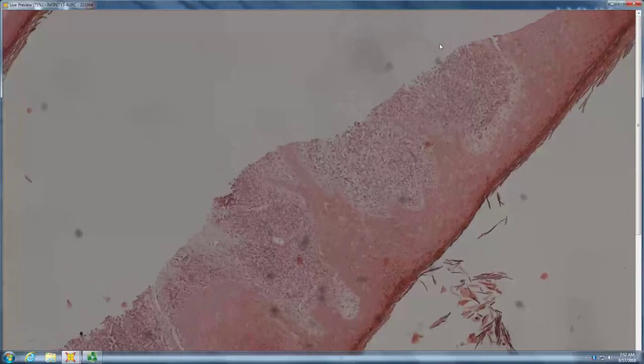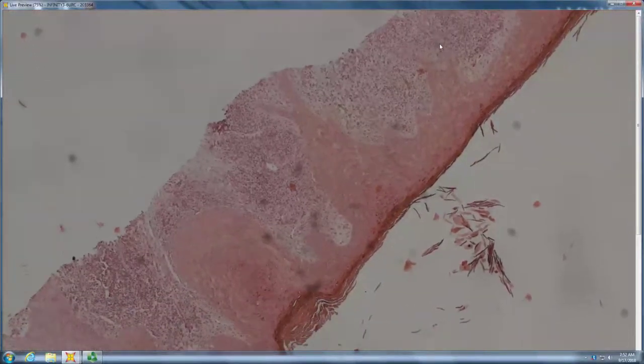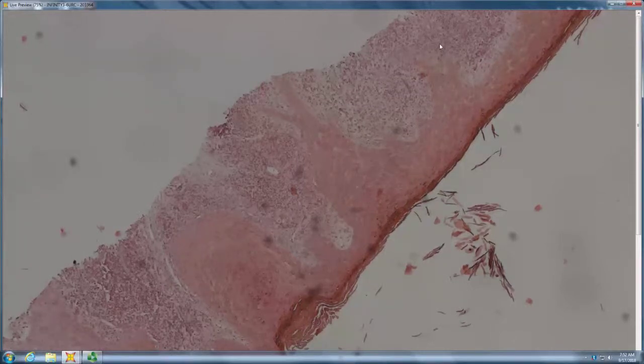Look at it up on the screen. It's probably better there. It looks like glassy epithelium. Glassy epithelium. Can't really see up there, so look in the scope. Okay. Sorry. Glassy epithelium. Do you have a basal layer? Not quite. Not really. Yeah, so maybe invasive. Kind of sawtooth with a band-like infiltrate, but it's glassy and has lots of PEH of the adnexal epithelium. So it's like a hypertrophic lichenoid dermatitis.